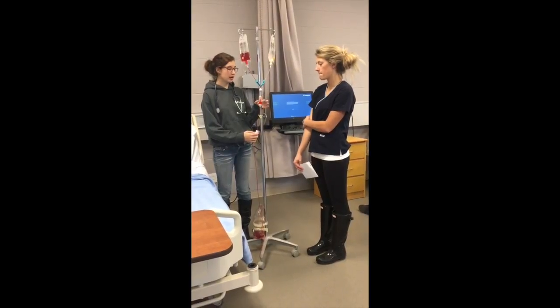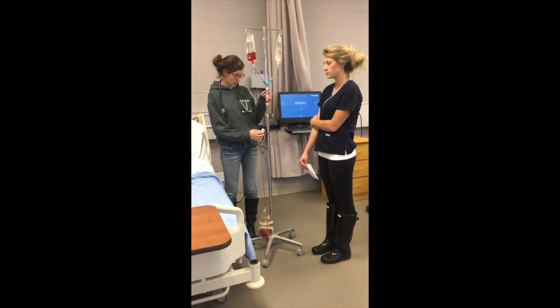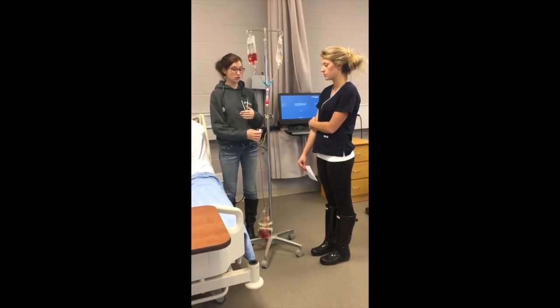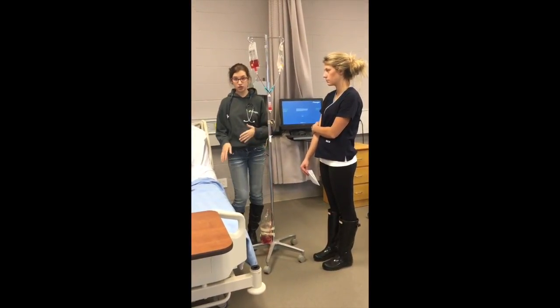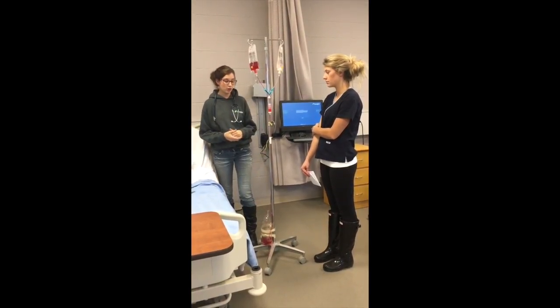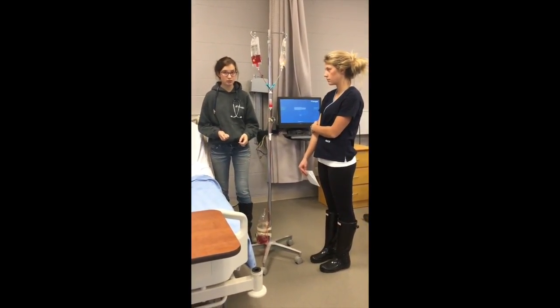So we're going to be using a gravity flow IV line, and by calculating the flow rate and drop rate, we're going to be actually having to count how many drops per minute, and in our calculation it was 21 drops per minute, and we'd count to make sure the appropriate flow. Once it's inserted and it's continuously flowing for that period of time, we are going to be checking the site of the IV, and we're going to do vital signs every 15 minutes.